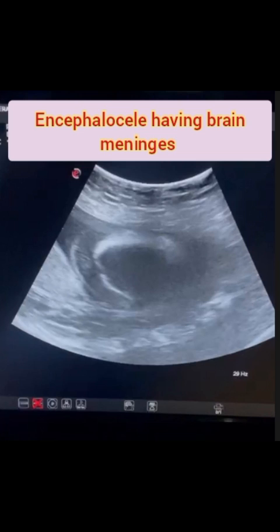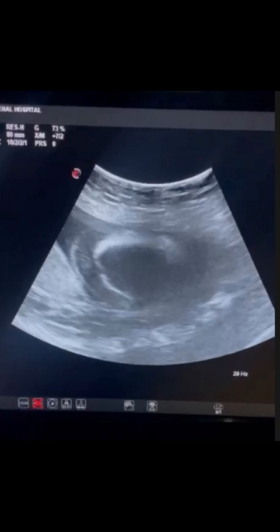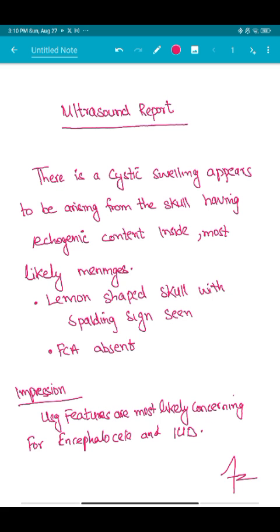My provisional diagnosis was frontal encephalocele, with differentials of occipital encephalocele, cystic hygroma, and skull hematoma. But the most likely finding in this case was frontal encephalocele. The next step was to manage the patient and plan delivery, as this was a case of IUFD.